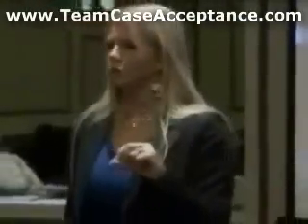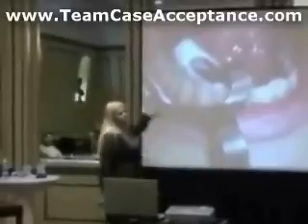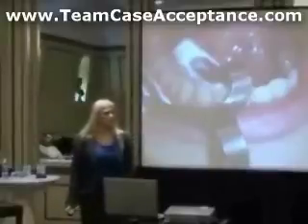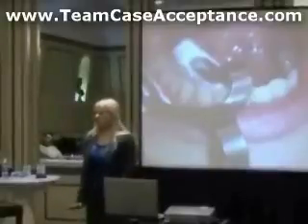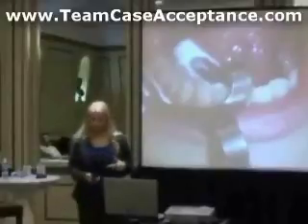All right, so other tips I could give you is use good tools. This is old school. It's a cotton roll holder. I think they call them a Garmer. I love the thing. Isolites work great. There's a lot of other things that really help you. But look at how that's isolated. I actually etch and seal the entire quadrant at the same time. 4 quadrants of sealants take me about 10 minutes for 16 sealants. So if you refine your systems, you'll be amazed at what you can do, okay?